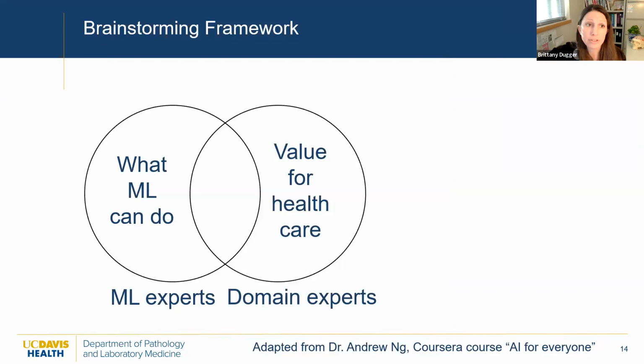And so again, to reiterate, if you want to start looking at machine learning in your practice, you need to have some brainstorming framework. And I can't emphasize this enough. And I'm very, very blessed to have so many great collaborators and colleagues that have helped me, because I'm more on the domain expert side. So I'm more on the neuropathology side, even though I'm here talking to you about machine learning. A lot of stuff I learned from my colleagues.